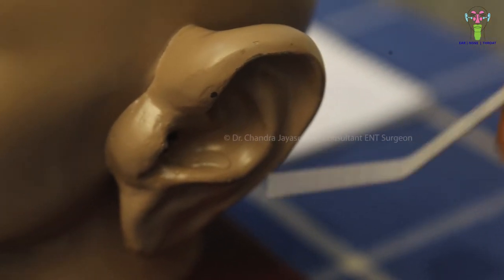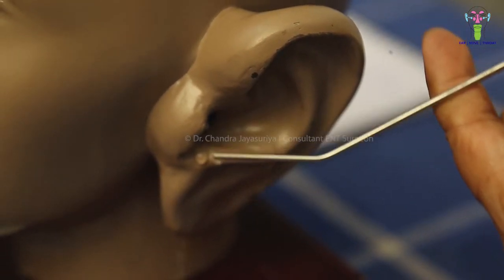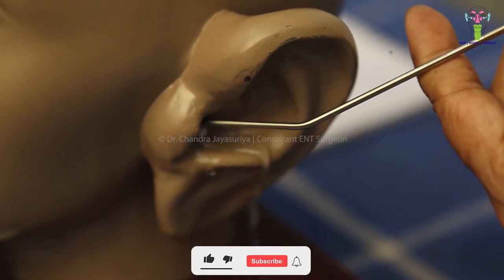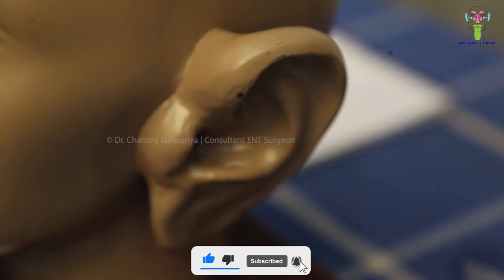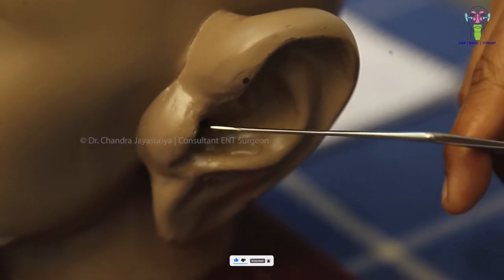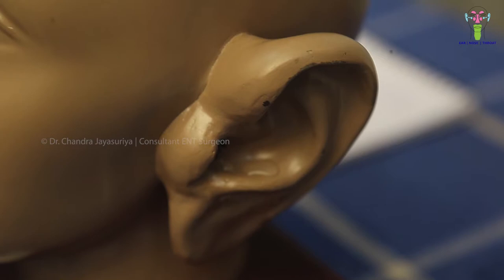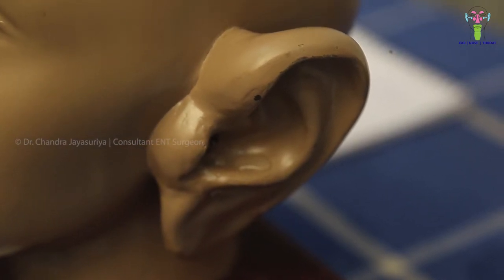After we put the ear drops this enlarges and fills the ear canal. Within few minutes it will enlarge in size. Now it's completely filling the ear canal.